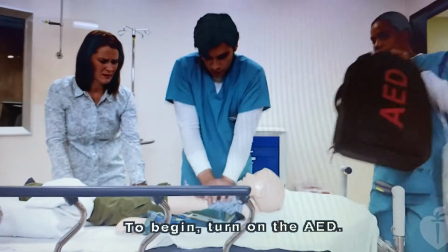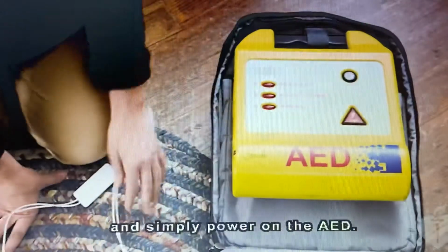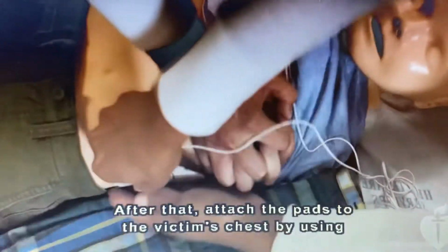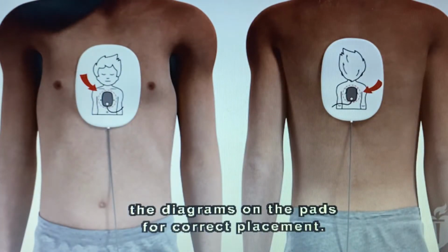To begin, turn on the AED. Just open the carrying case or the top of the unit and simply power on the AED. Some devices will power on automatically when you open the lid. After that, attach the pads to the victim's chest by using the diagrams on the pads for correct placement.